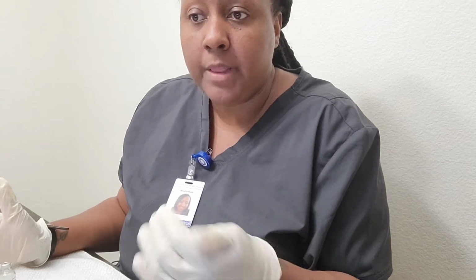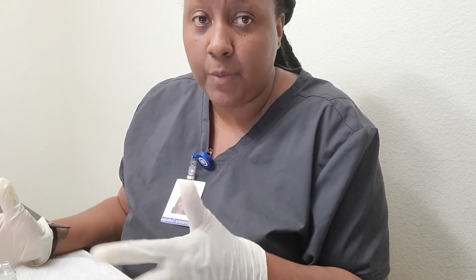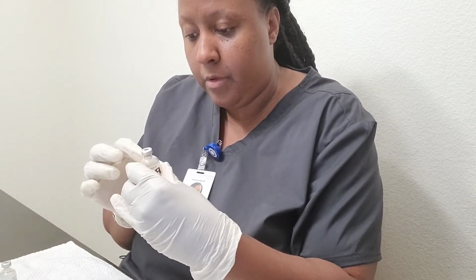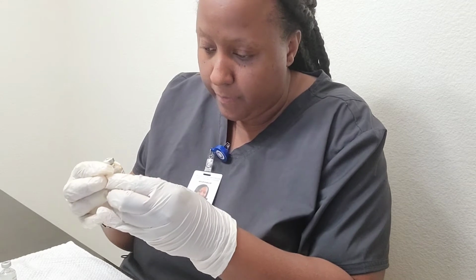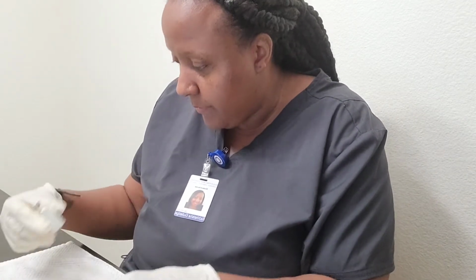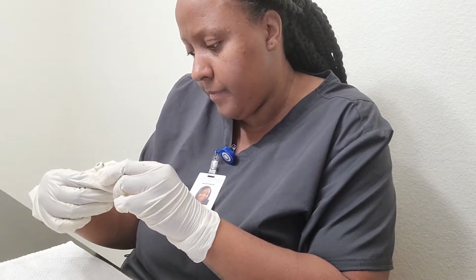Okay. Also, I would like to note that I will compare the insulin label with the medication administration record. So with the EHR, I would check the expiration date on the vial. Okay, so we are good.